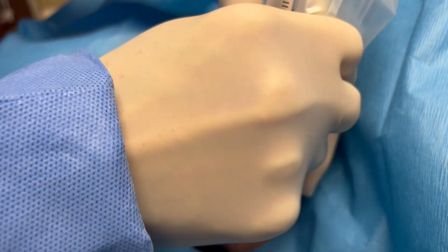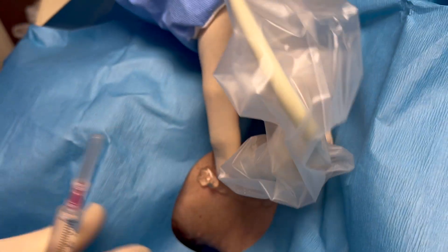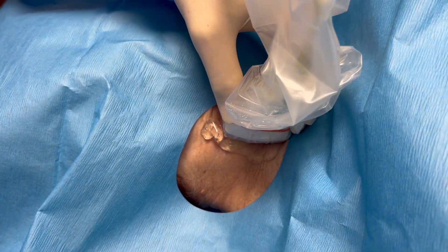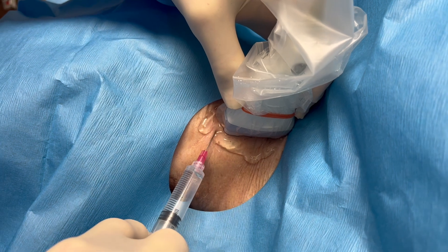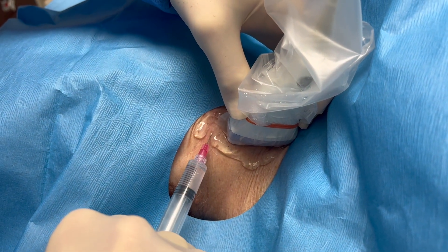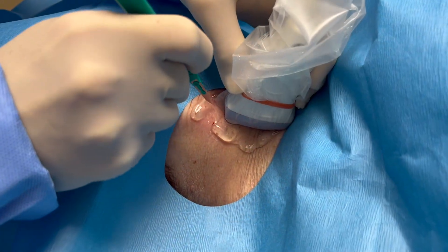The next thing you need is an ultrasound setup and all the sterile drapes to make the procedure itself sterile. Once you're all set up, you need to numb the patient because these things are large catheters and they're particularly uncomfortable. So make sure you use a lot of lidocaine to numb them.